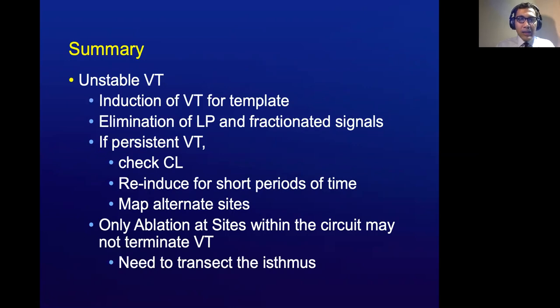Only ablation at sites within the VT may not terminate it. We may need to transect the isthmus before the VT is actually terminated. Spot burns may not actually terminate the ventricular tachycardia.